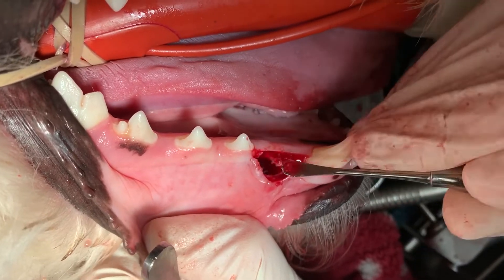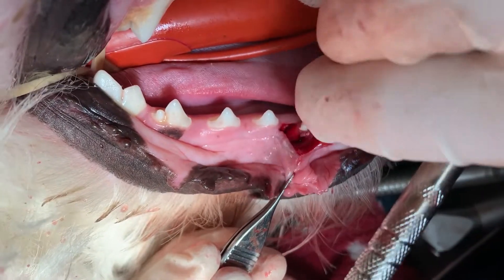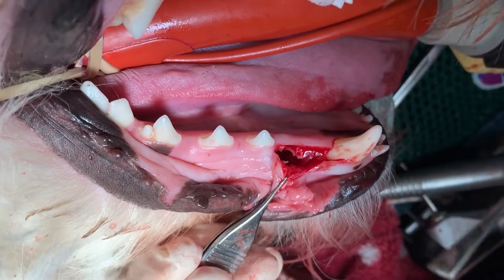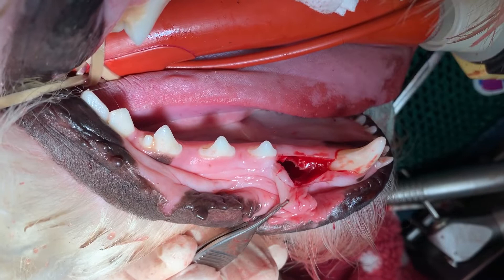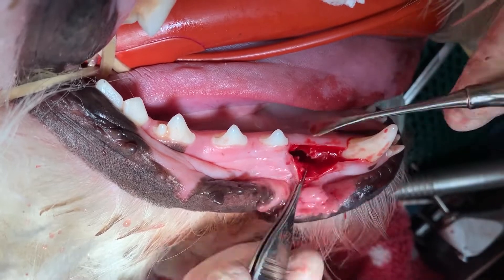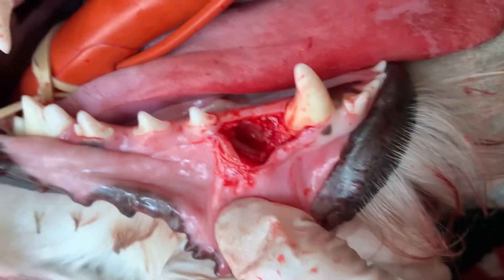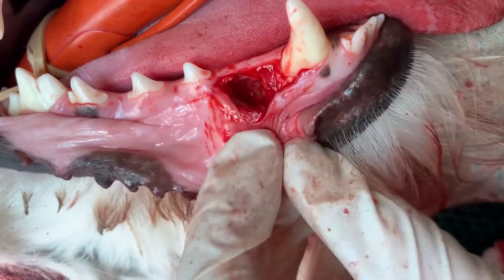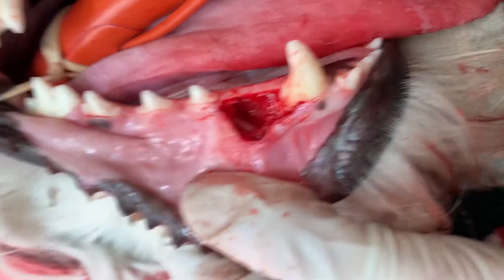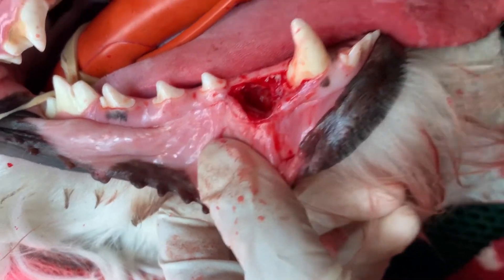Thankfully this owner caught this quickly. He's a human dentist and an oral surgeon, so he recognized that there was something going on. We talked about it and had this dog in for surgery pretty immediately. It's really nice when we can collaborate with our human counterparts, and it makes it wonderful when we have such great, understanding owners who recognized we needed to address this pretty quickly. There's the sulcus now — it's quite the large hole. We're going to bring that tissue up and get everything closed.